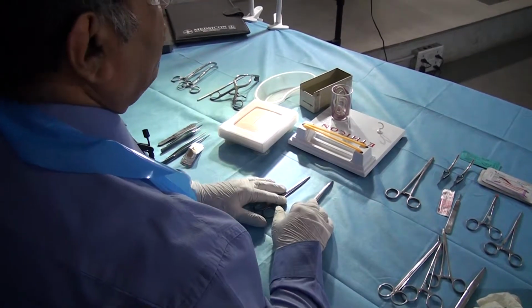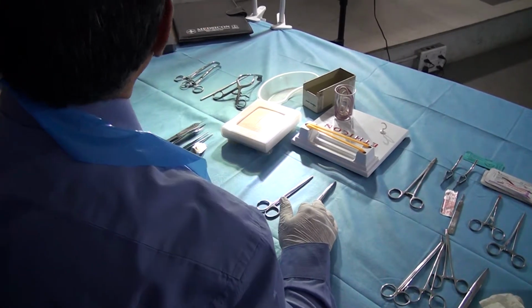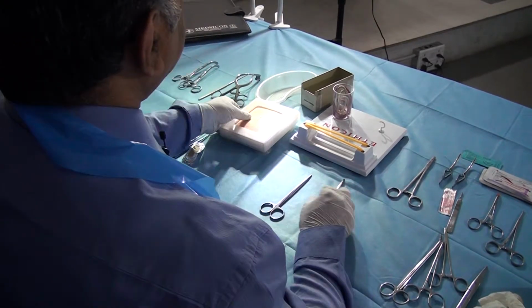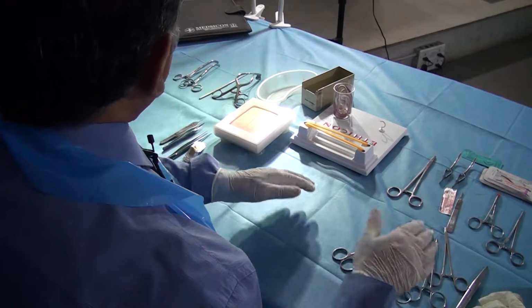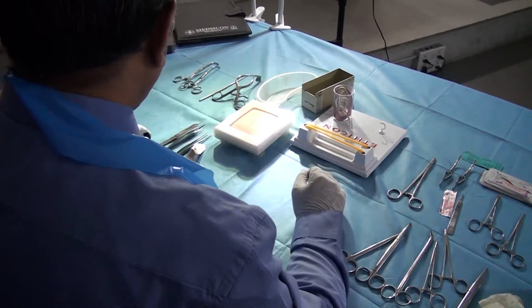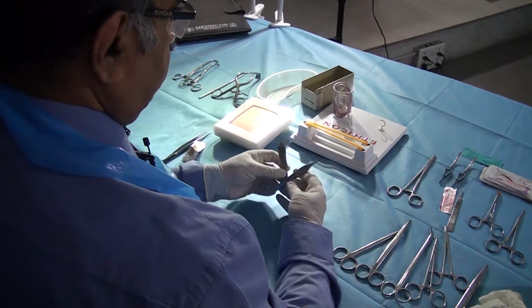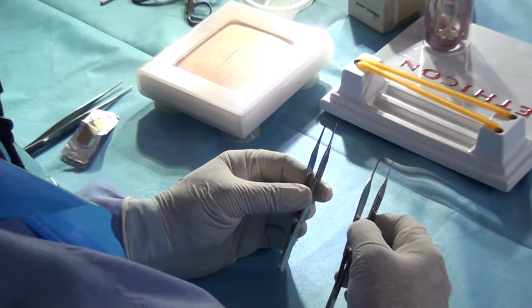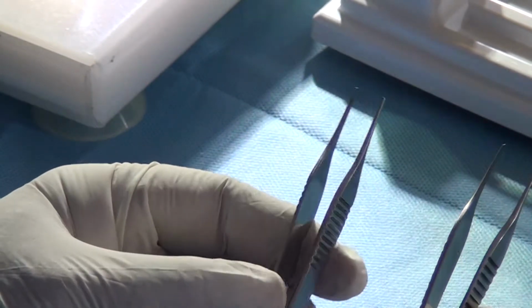Meanwhile, I'm sure they've got the blade sorted. Manish, you can call the ethical person. I'll sort it. The third instrument, we'll finish with the instruments, then we'll get to doing it. Don't worry. Forceps. They are arranging a bowl for you. Vinay, yes, blade to chain or something. Yes, they should have done it. Yeah, they also put distribute.